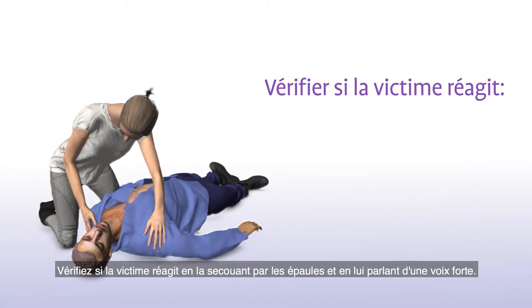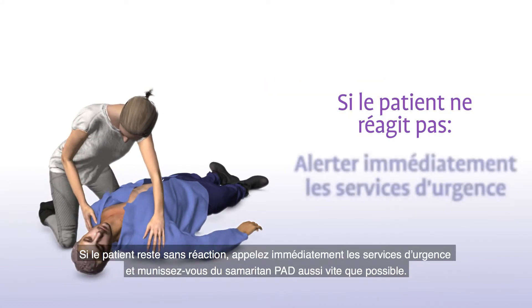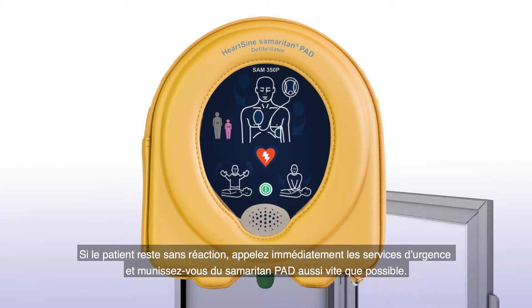Check for a response by shaking the victim by the shoulders and talking loudly to the victim. If the patient is unresponsive, immediately call for medical assistance and get the Samaritan PAD as quickly as possible.